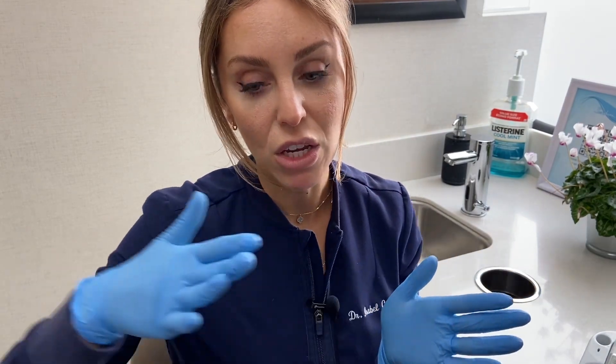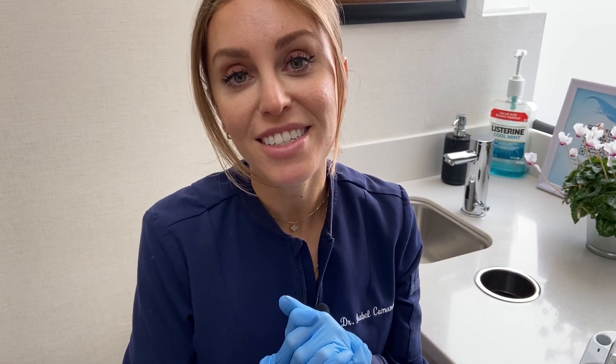Again, it speeds up your healing. It can reduce some of the symptoms. So it's a nice thing to have in your arsenal. Some of the studies show that it can also increase the length of time between your next cold sore — so it can spread them out more. If you're interested, ask your dentist if this is something that they offer at their office.